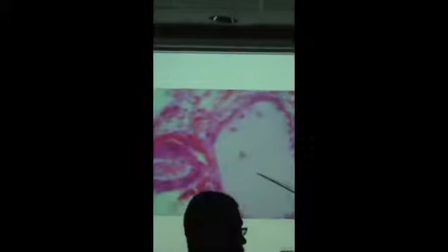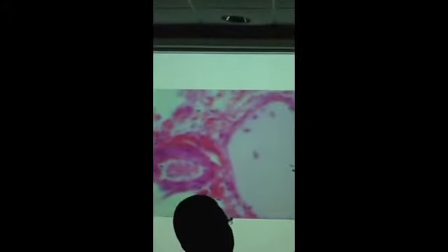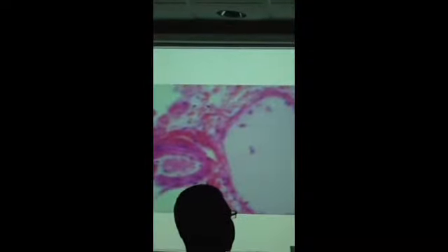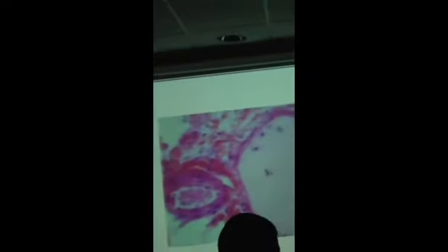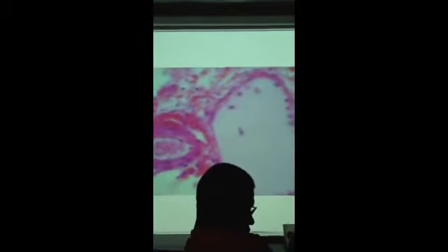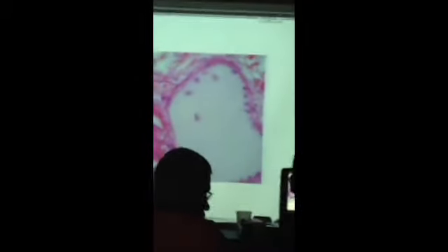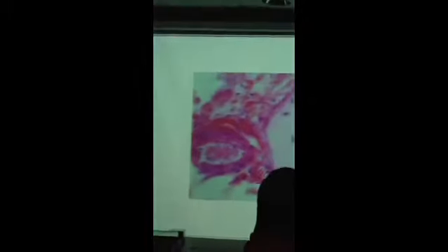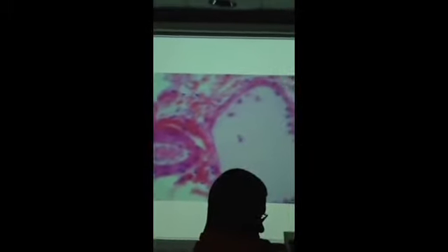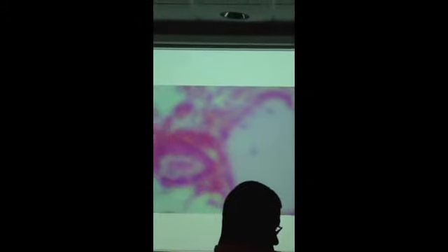Okay? So, portal venule, what kind of blood does it bring in? Blood rich in what? Nutrients. Because the hepatic portal vein, remember, is an unusual one. It's draining capillaries in the GI tract full of nutrients and feeding capillaries in the liver. So it's running between capillary beds, which we don't expect. Usually veins drain capillary beds, but they don't feed capillary beds, like here. The other blood vessel, of course, brings in oxygen-rich blood.